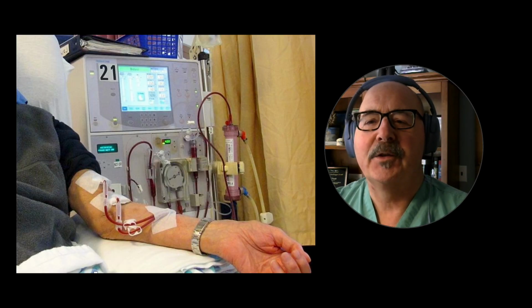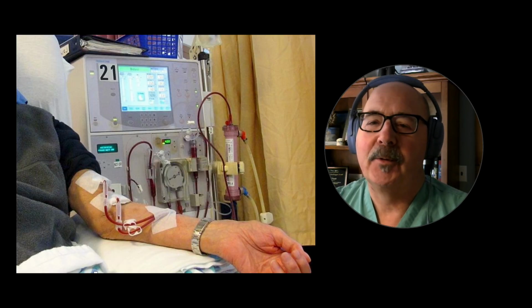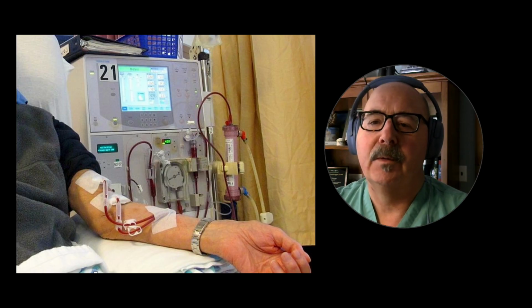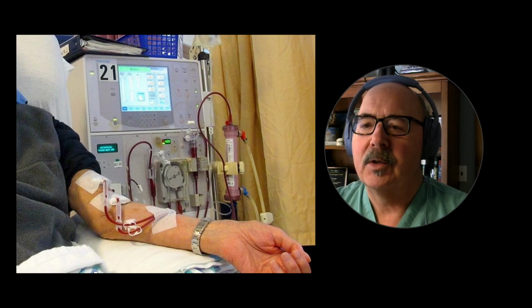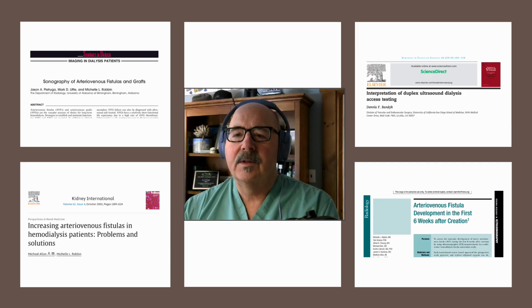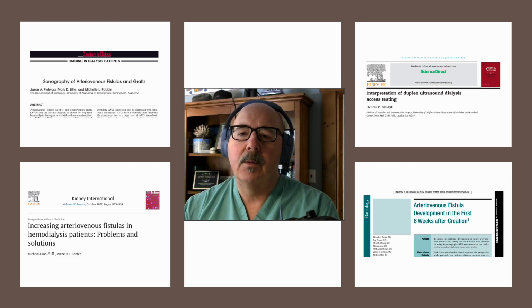If you're not on the listserv UVM FlowNet, you've been missing a great discussion about dialysis access evaluations with duplex ultrasound. There seems to be a general lack of consensus on how to correctly perform volume flow measurements, where to take the measurements, and what the results suggest. There have been several definitive papers on dialysis access surveillance, and I will include a few of the references in my written comments. I have collated from these articles 10 of the key things that I think we should keep in mind when performing volume flow measurements.